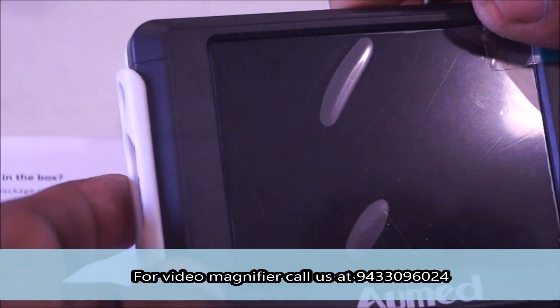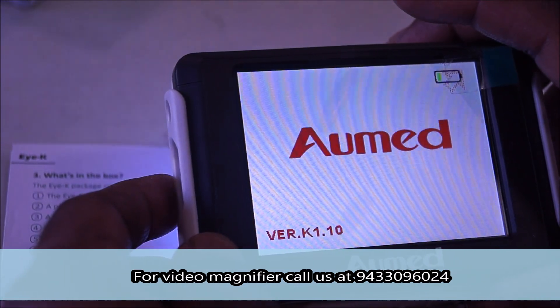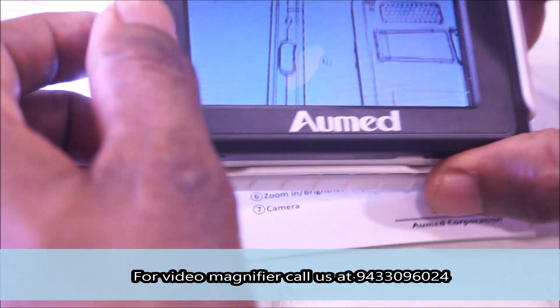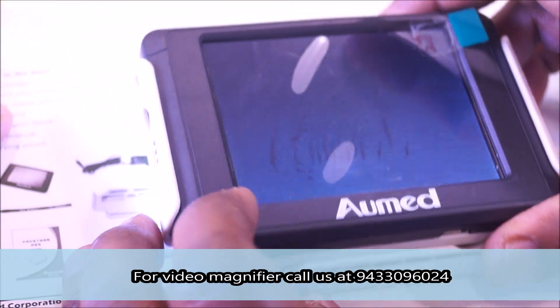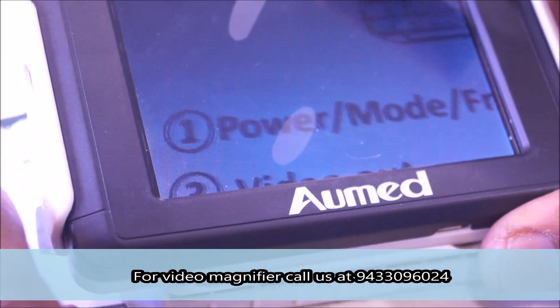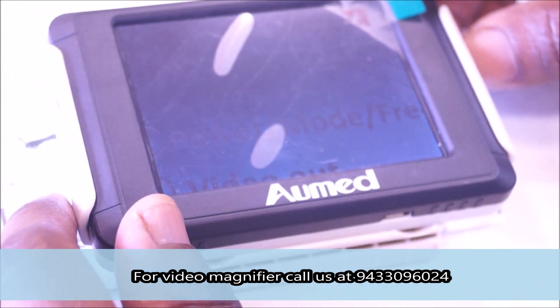The patient switches the device on using the right side switch. He is asked whether he can read the text on the paper without the magnifier — he says no. With the magnifier he is able to read it. He is then asked how he would increase the magnification and demonstrates pressing the right side switch to increase the letter size.